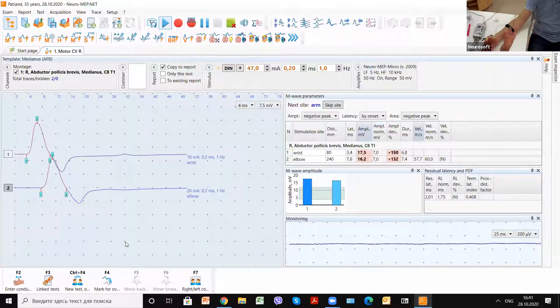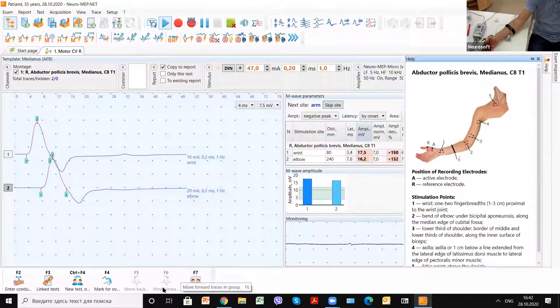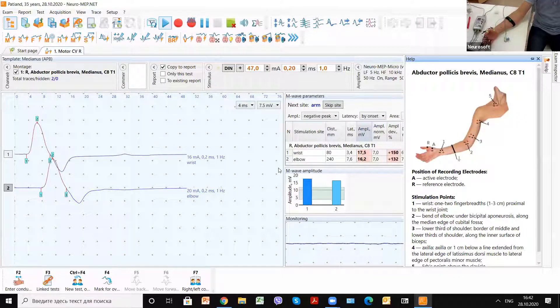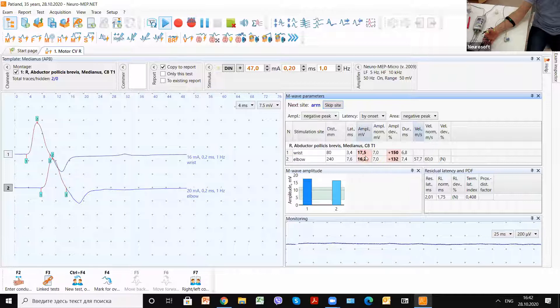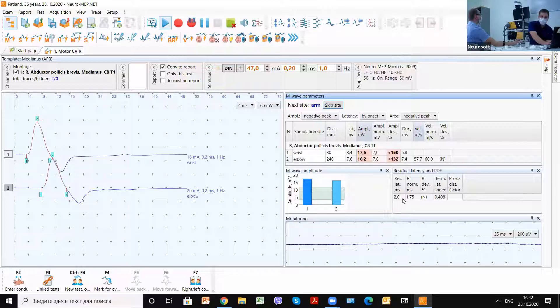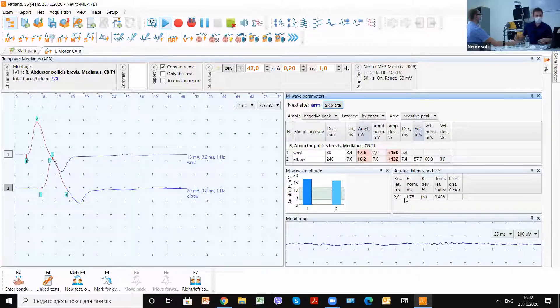Basically you can use two stimulation points, though some doctors add more for specific purposes — up to five points of stimulation. Additionally, palmar stimulations can be used, for example for carpal tunnel syndrome assessment. The results here show good answers with normal conduction velocity and normal residual latency, which is connected with the most distal parameters of the nerve.